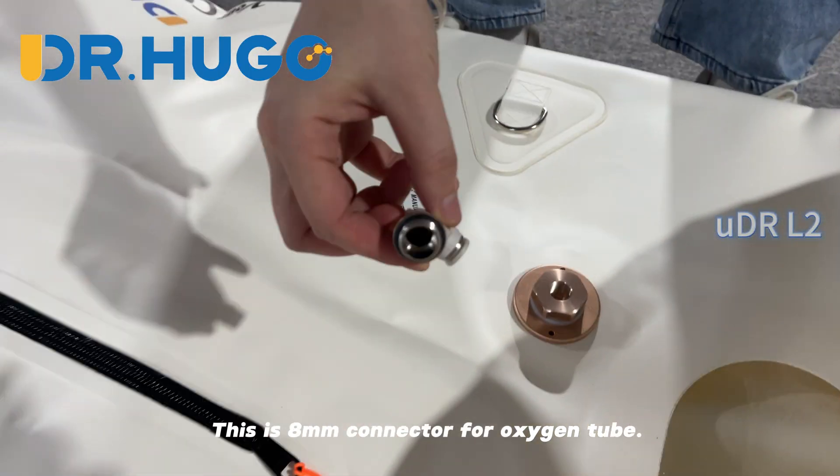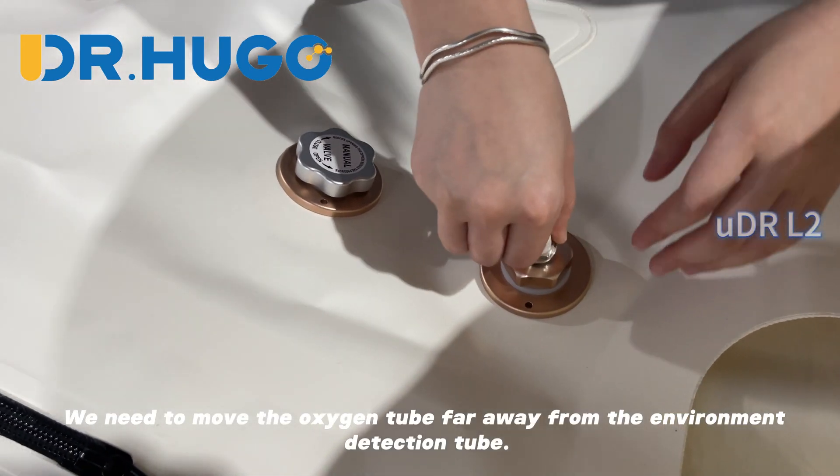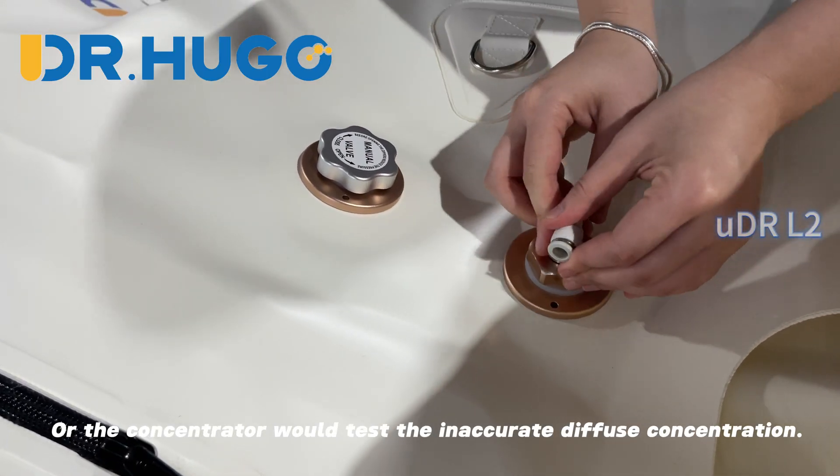This is the 8mm connector for the oxygen tube. We need to move the oxygen tube far away from the environment detection tube, or the concentrator would measure an inaccurate oxygen concentration.